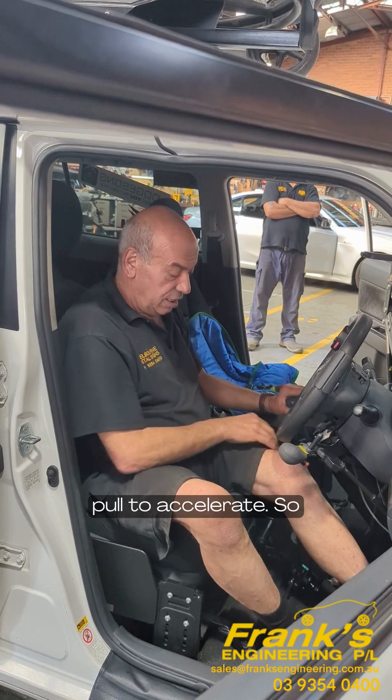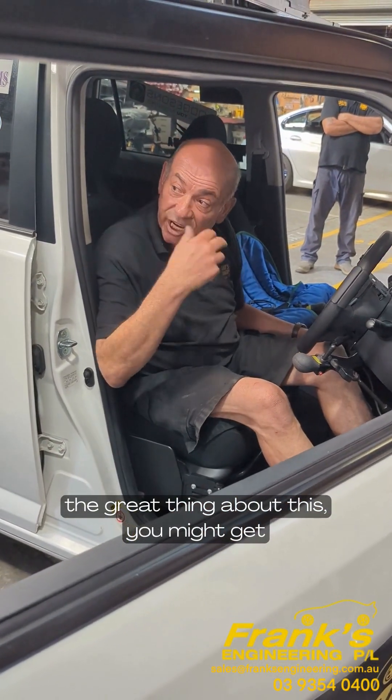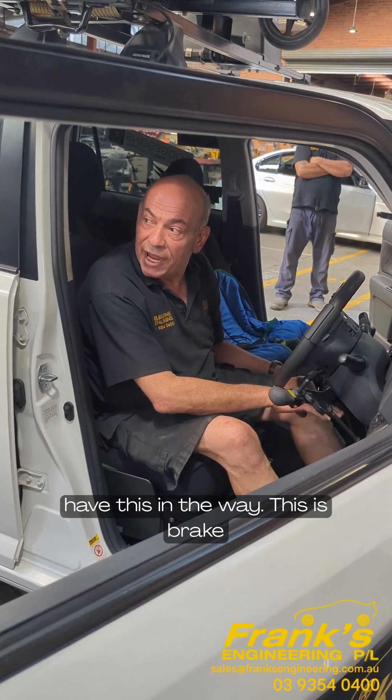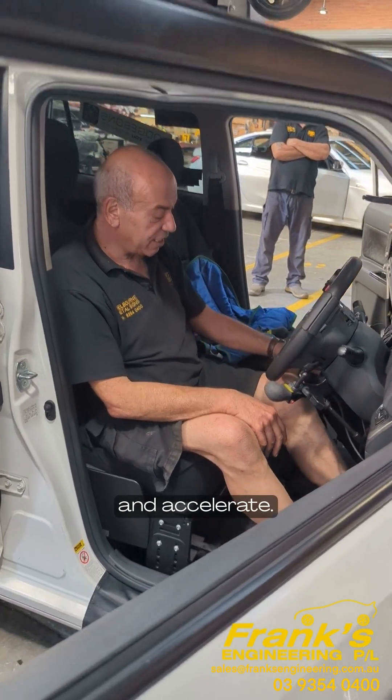The great thing about this — you might get a client that's really tall. Let's move this out of the way. Give it a brake and accelerate.